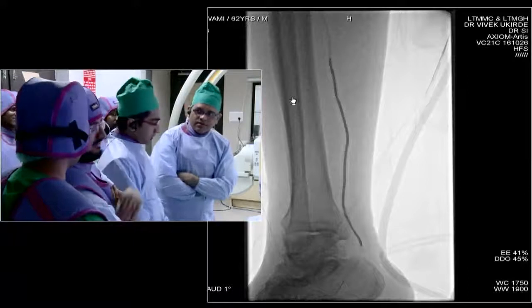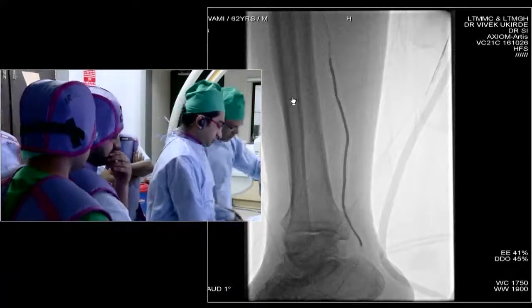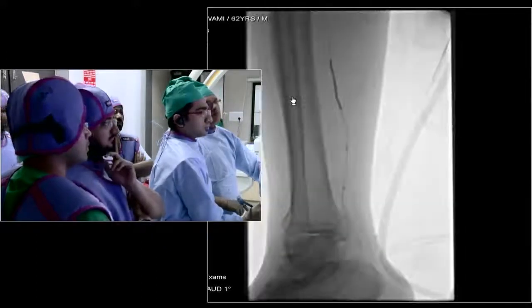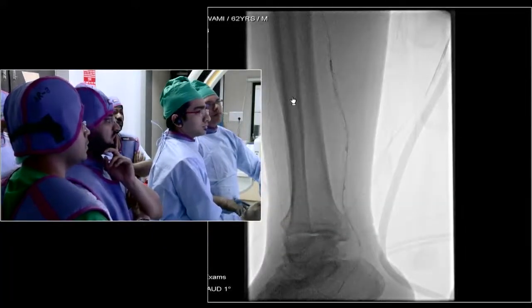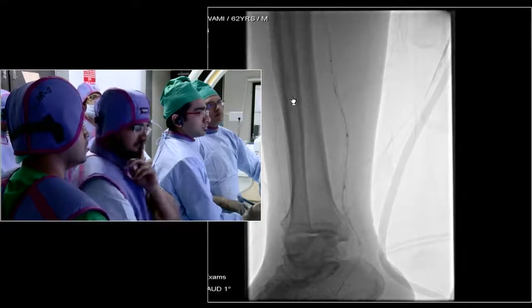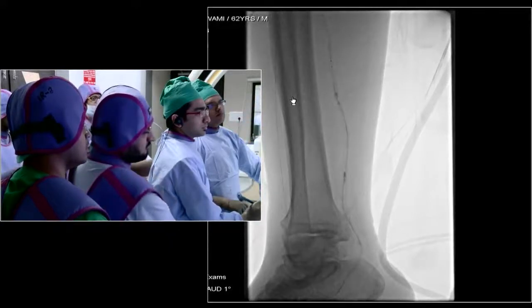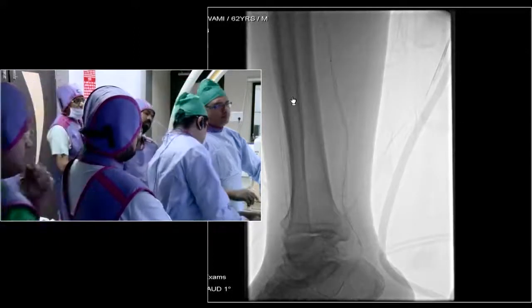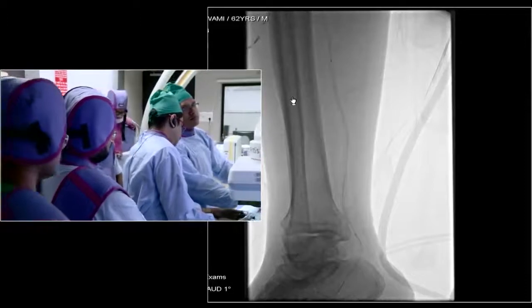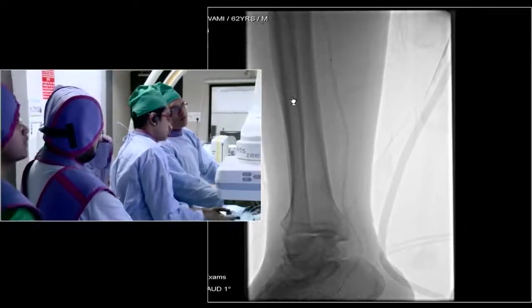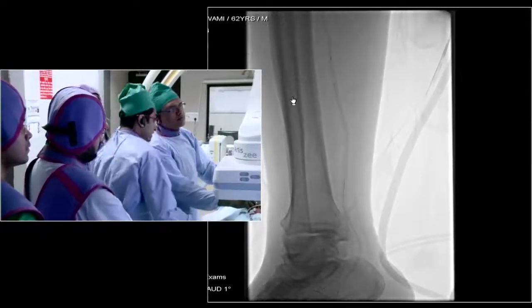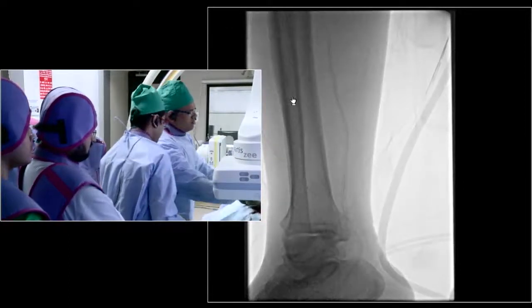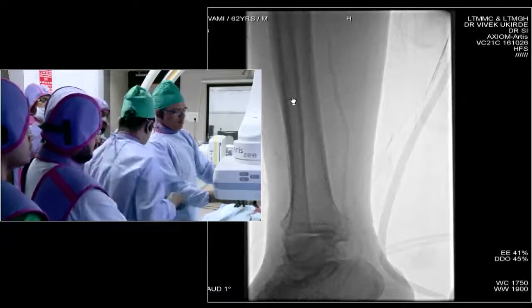We are now deflating the balloon and probably placing the scaffold. These calcified arteries are what we normally see in our diabetic patients, and with diabetes and smoking together, the disease is quite extensive.